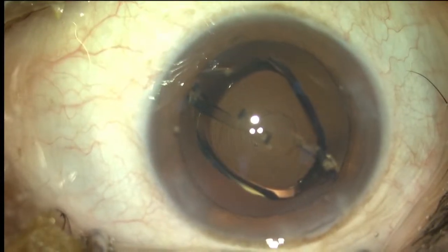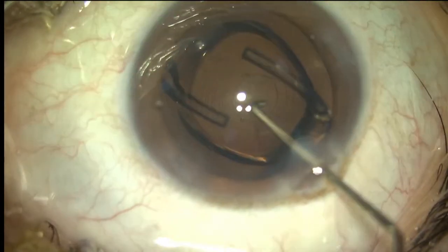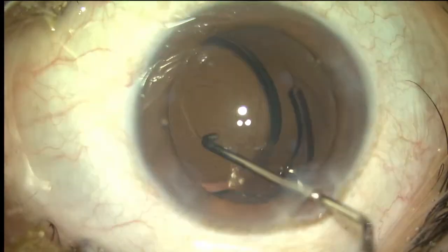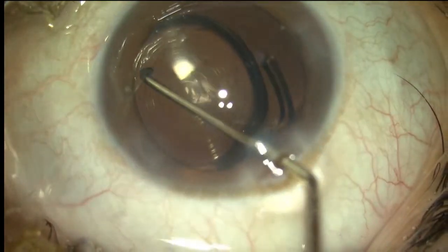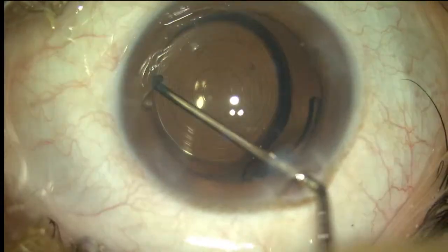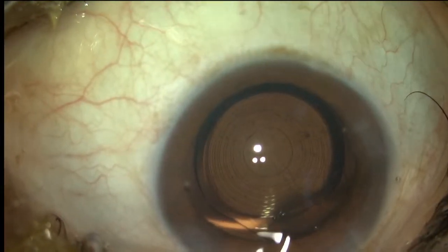You can see the rings of the IOL. It takes its time to unfold. Very minimal.